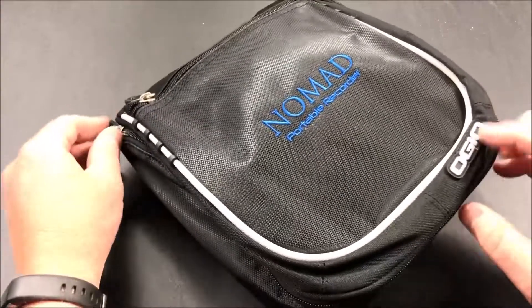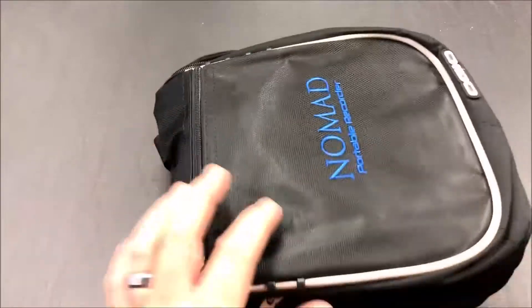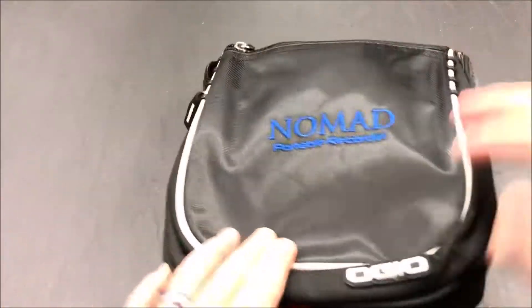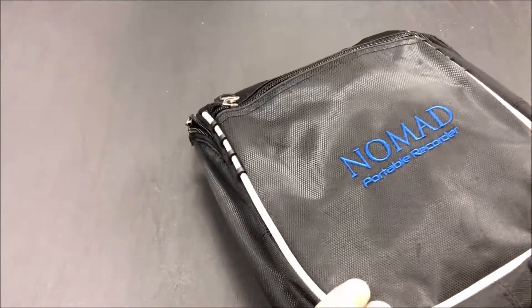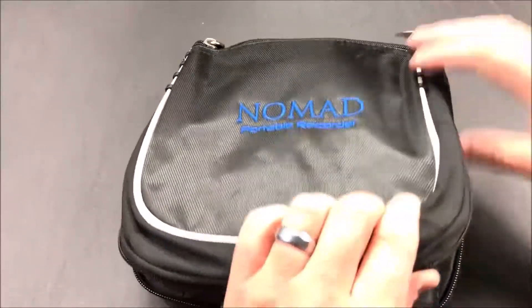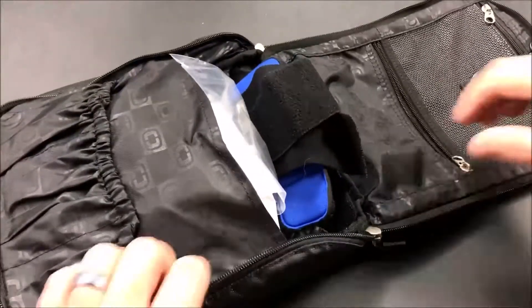I picked this gear up today and was shown how to use it, so hopefully I can remember that which is only a few hours from now when I go to bed. This is going to be a one-day sleep study — just one night — and I have to wear it through the majority of the night, hopefully. You'll see why it could be an issue, but we'll see.